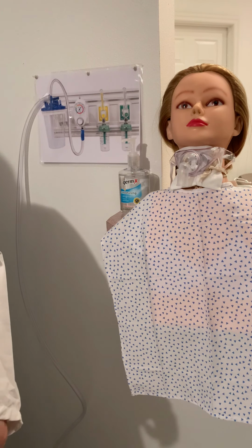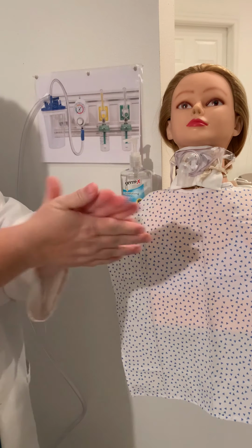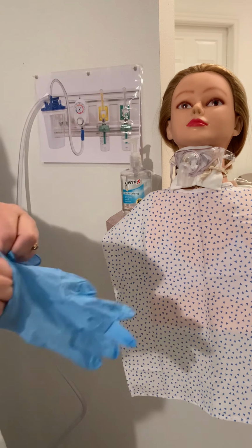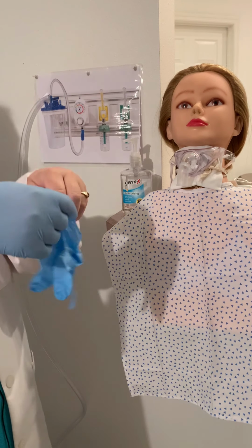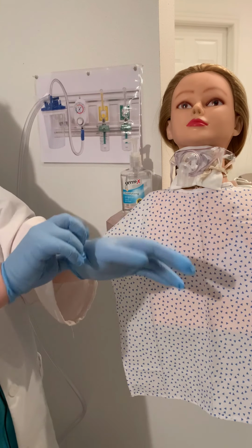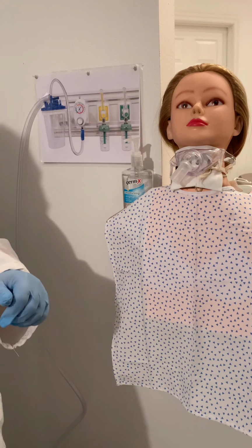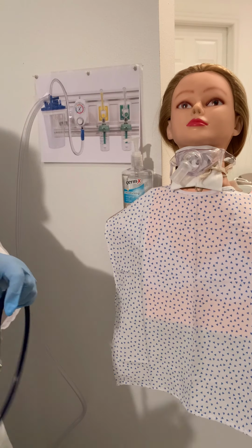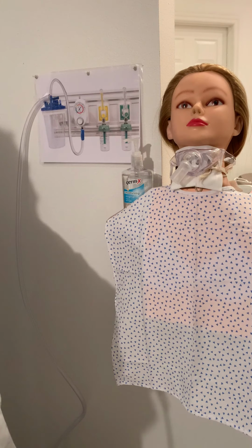And then I'm going to go ahead and put some gloves on. So I'm going to wash my hands first. And we'll get our gloves. All right, so then I'm going to do an assessment. I'm gonna assess her respirations for depth and rate. I'm gonna look for signs of dyspnea. I'm gonna look at her color, make sure she's not cyanotic.